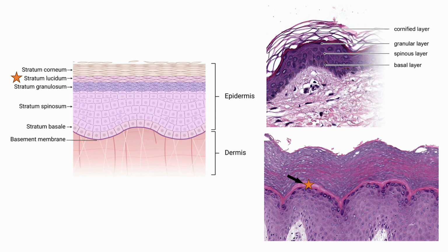And this one is the acral skin. It has the presence of the stratum lucidum, and in non-acral skin there shouldn't be a stratum lucidum.